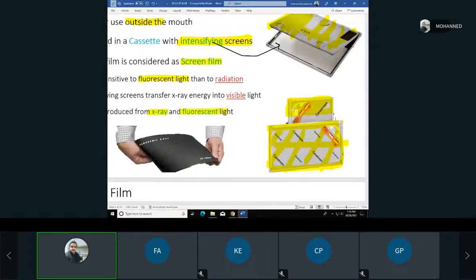If it's for an orthodontic purpose described by the dentist, yes, they should take it, but not for just a regular thing.